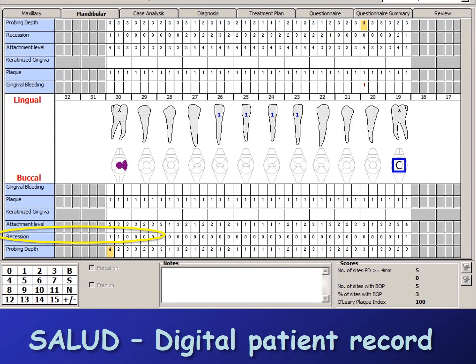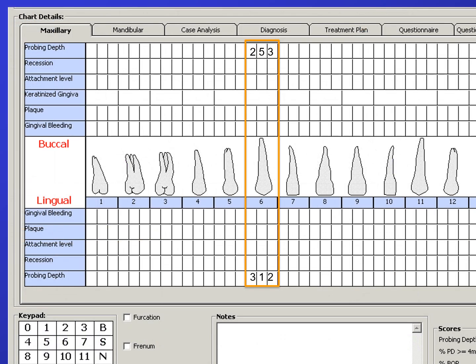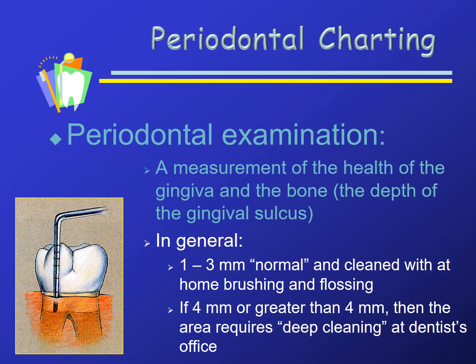Here we see a charting with most of the numbers recorded. At the lower part of the orange rectangle we see 3, 1, 2. The 3 means a 3 mm probing depth at the distolingual of number 6; the 1 indicates a 1 mm pocket at the straight lingual; and there is a 2 mm probing depth at the mesiolingual. When a pocket depth is normal, like 1 to 3 mm, this is a healthy pocket that can be kept clean at home with brushing and flossing. When the pocket is 4 mm or greater, deep cleanings are needed.